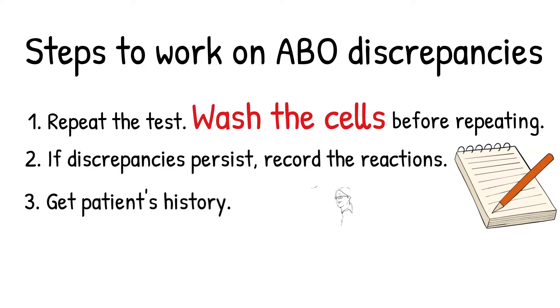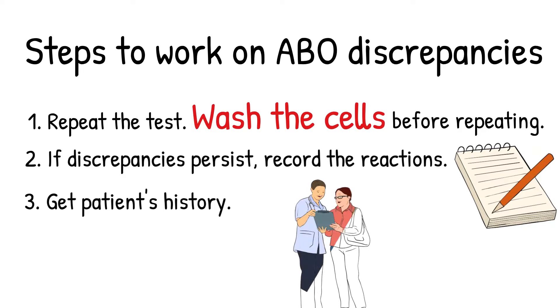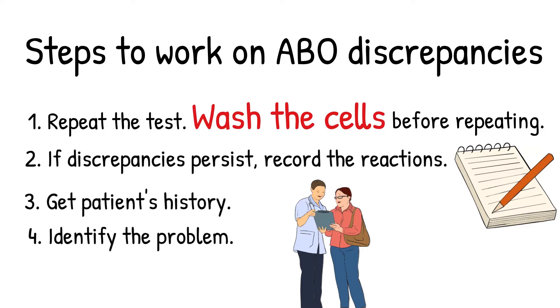Third, get patient history like patient age, recent transplant, recent transfusions, or any health conditions that the patient has. Fourth, identify if the problem is coming from the patient's forward type or reverse type by looking at the reactions. Ask yourself if you are looking at weaker than expected reactions or a missing reaction. Then follow the guidelines as we talked about in the previous video.